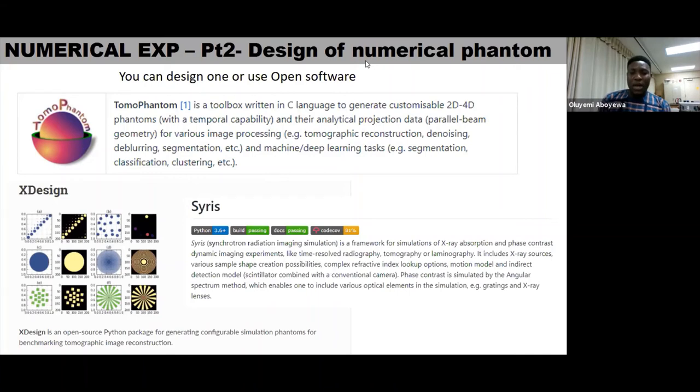There's a question on the energy range for dual energy CT. Most of the ones I've seen are 80 kV and 120 kV, and they can take two images simultaneously. The different vendors have different ways they implement it. Some machines now have two sources that take the image simultaneously.